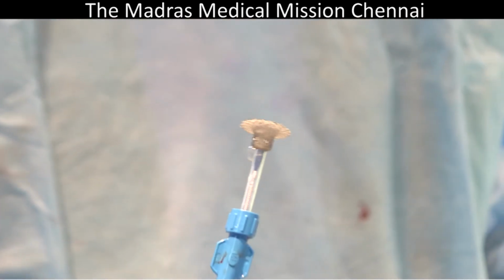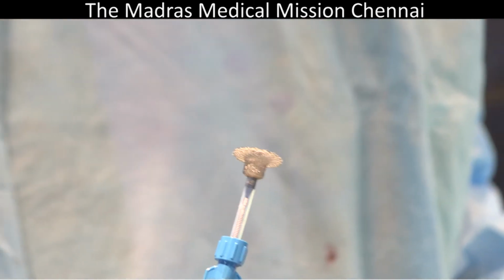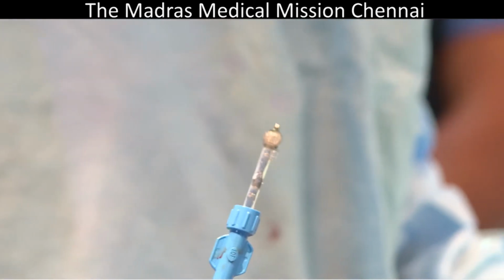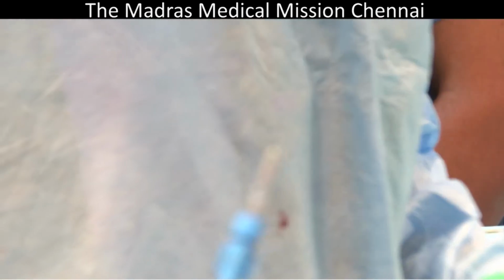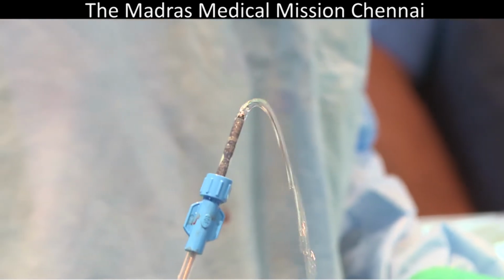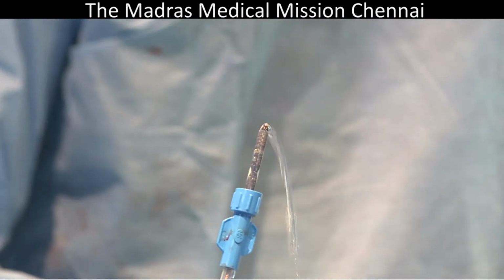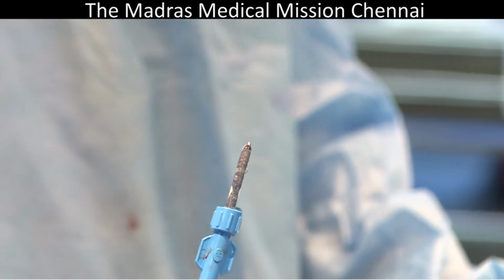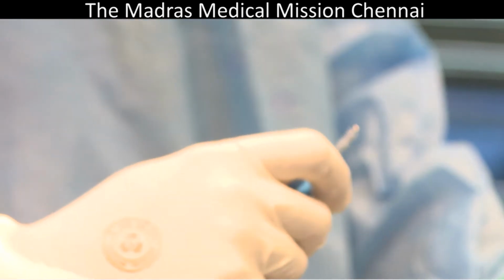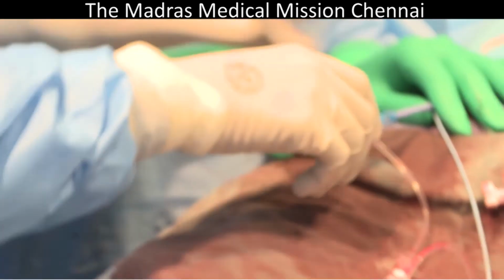So I am loading it. This is the memo part asymmetric device made by the Lepu Medical, which is one of the Chinese companies which manufactures nitinol based devices, and we are using one of those devices. So I have... Waist size? The waist size is 12.